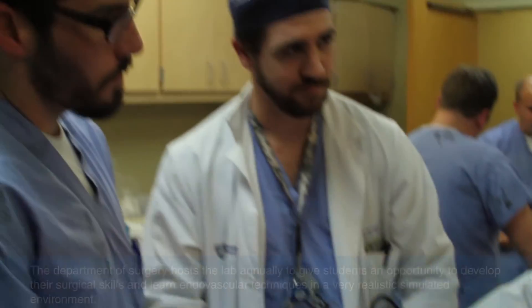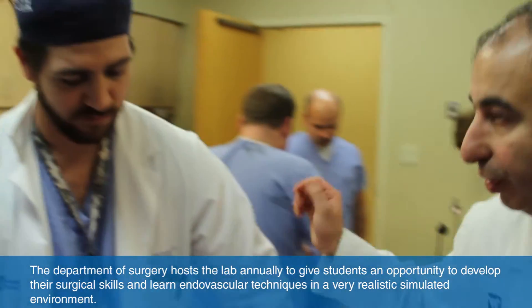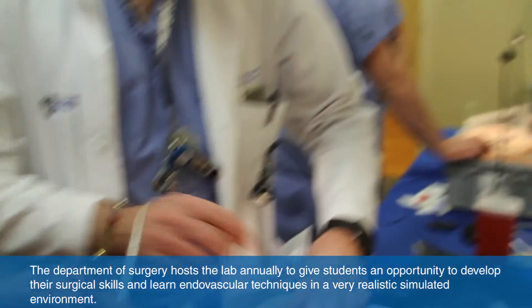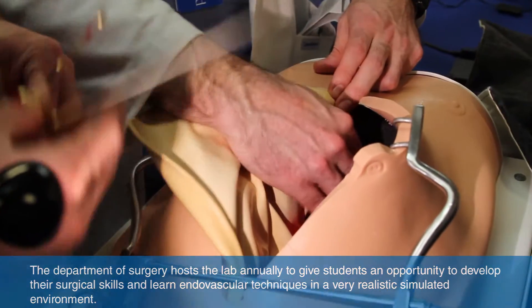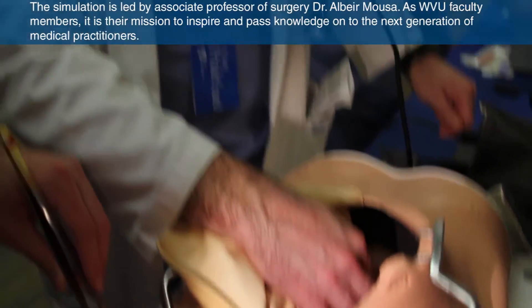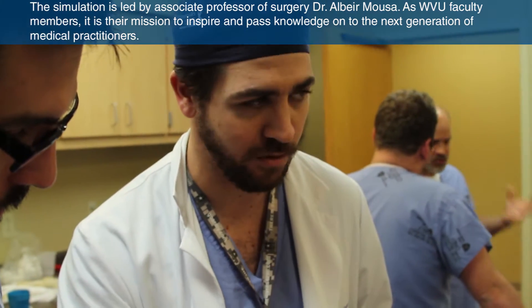Once you've done this, you're going to open the right retroperitoneum, midline. You take your mets and come right here. If you stay anterior to the aorta, you're going to be okay — except until you get up in this area, which you have to watch out for.